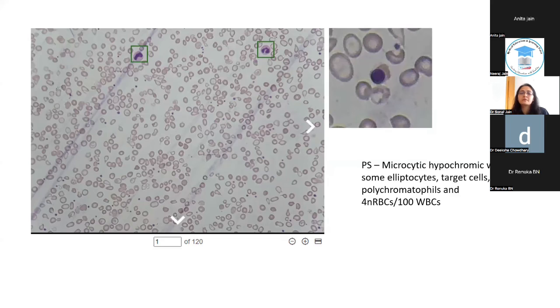It's important to keep it in mind because these patients should not be given empirical iron and folate. The folate is needed at some time point, but iron is not at all needed for them. Thalassemia intermedia has more iron overload, even more than thalassemia major. So it is important to not give them iron. It is important to see these nucleated RBCs. If you see nucleated RBCs, you do not see an iron deficiency anemia unless it is a 3 or 4 hemoglobin. If you see NRBCs and a microhypo picture, it's not iron deficiency, it's something else.